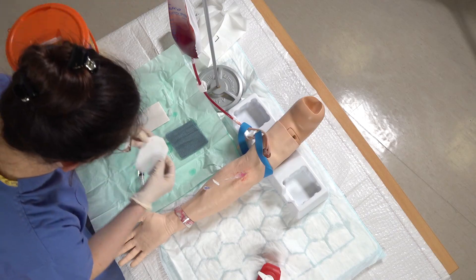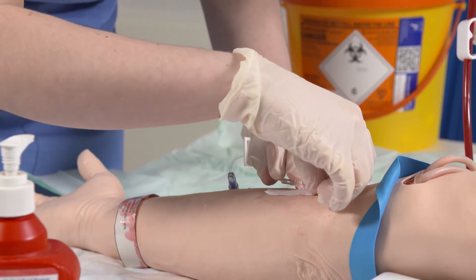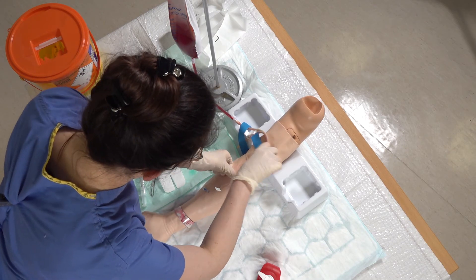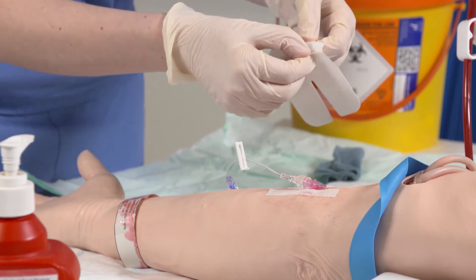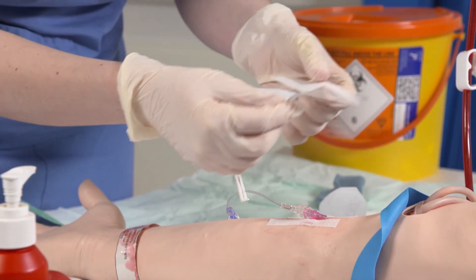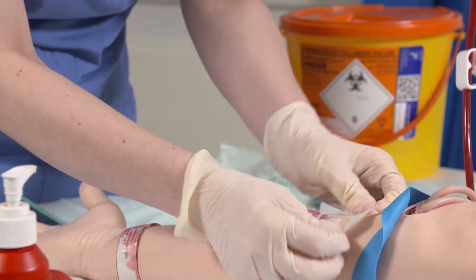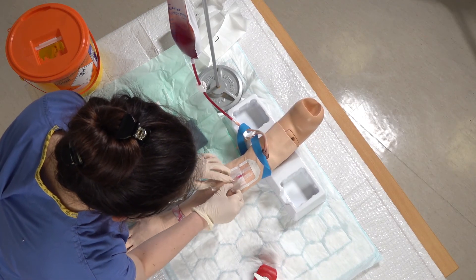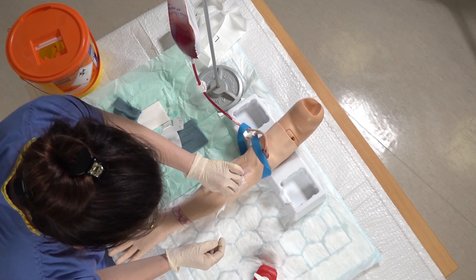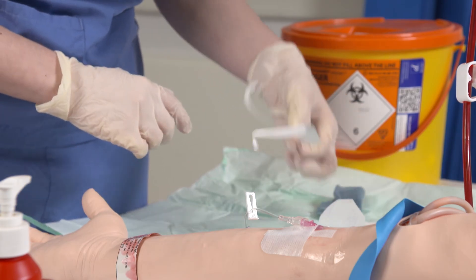Next we'll just put the dressing on. There are two strips on the dressing you can peel off — they go over each wing of the cannula to secure that in place. There's a central segment to this dressing: remove the front first and then remove the back of it, placing these two wings either side of the cannula, making sure that the entry site of the cannula is visible in the clear pane. Just remove this extra paper bit from around the edge. You would usually date and name when you put the cannula in and just place it on top of the sticker.